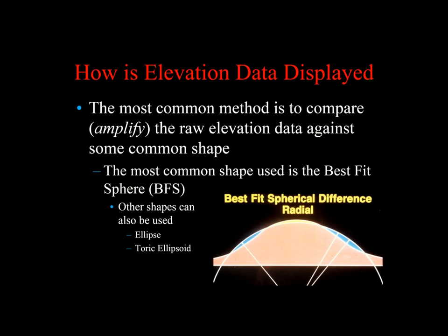Now, in truth, you'll almost never see a picture as pure as that, because as we know, most patients with keratoconus also have high astigmatism. So what we're looking for are those positive islands that have been superimposed on an astigmatic picture.